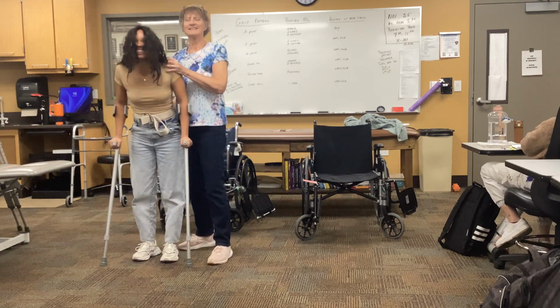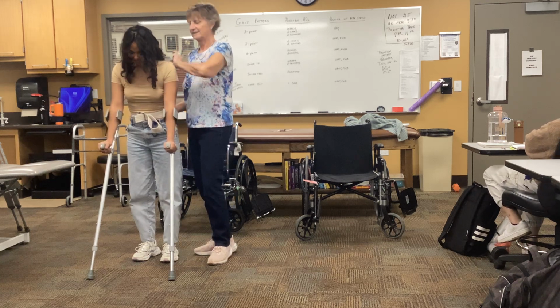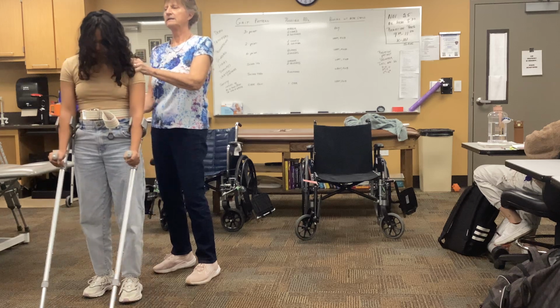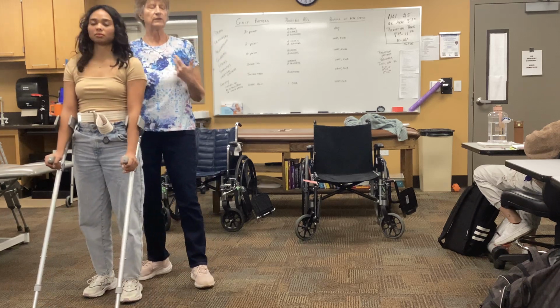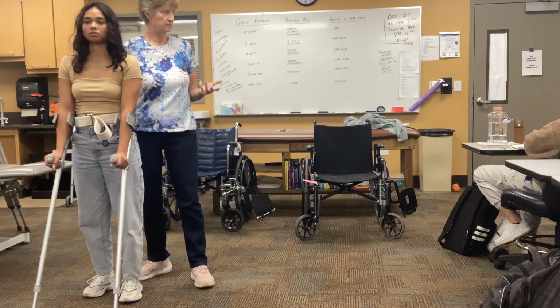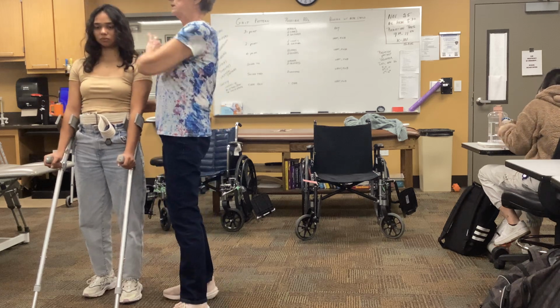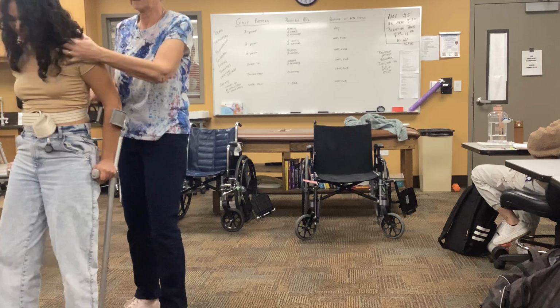Don't bend your knees. Okay. So quick bend and back into the stable position. They learn to do this fairly quickly, otherwise it would take forever to get across the room, okay? This is their stable position, so bend, lift, okay.